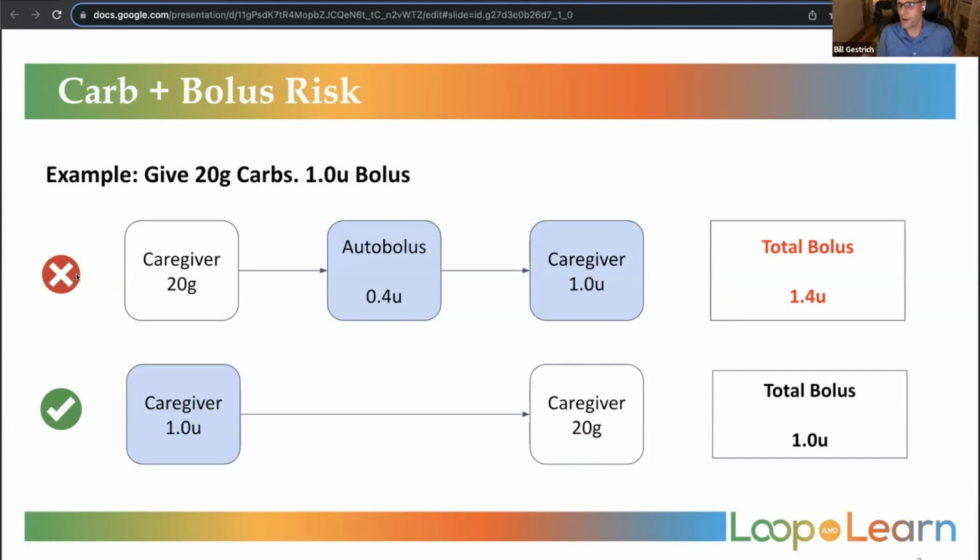I didn't mention throughout all this that it means you're going to have to calculate or estimate these bolus amounts. So when you're trying to input carbs, you don't have the benefit of having Loop tell you how many units you need to deliver. In the future, we could potentially figure something out like that. We don't have any capabilities now, so you'd have to find a way to estimate that. And I'm sure there's plenty of tools and such. So it's going to be less precise than when you're working directly within Loop. But this is, I think, a reasonable workaround for now.